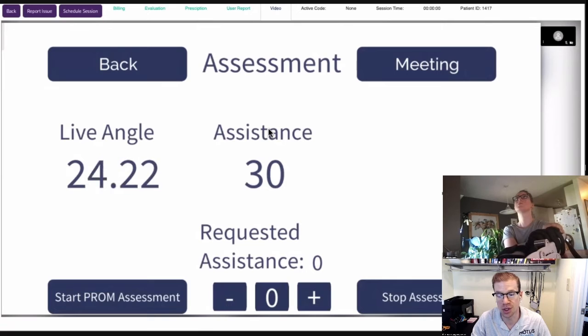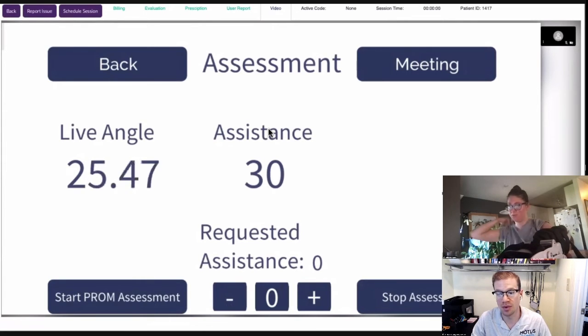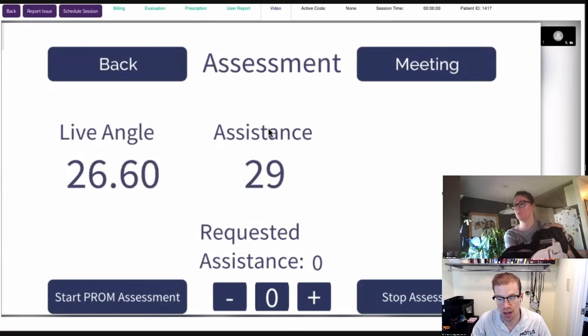Very good. So you see on the screen 24, try to make that go higher. Try to go to 24 and a half. Try to go to 25 if you can. Really good. And relax. Okay, good. Now try to move up again. Watch the screen and try to make that number go up as far as you can. Whatever you're doing, try to make it go up. Good, good. Can you go to 27?